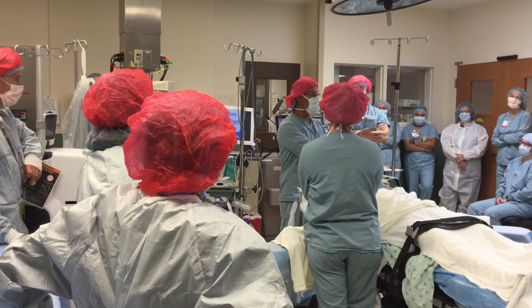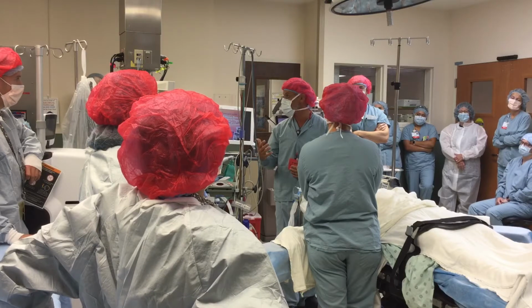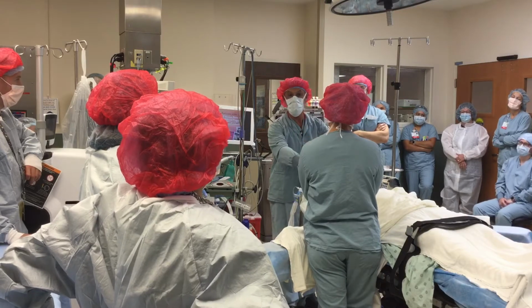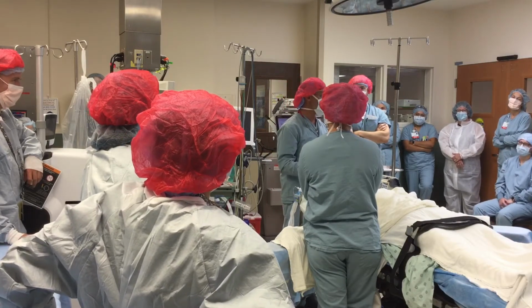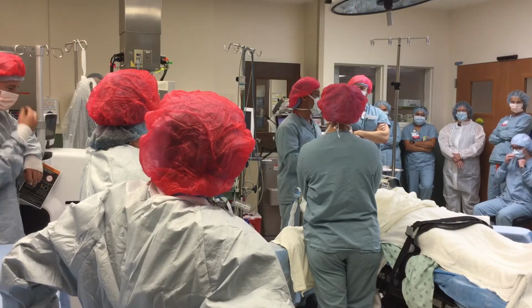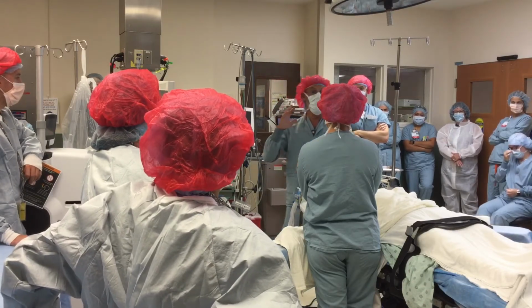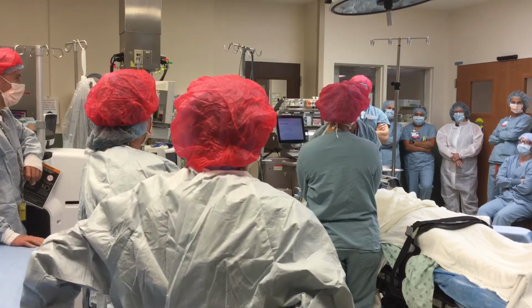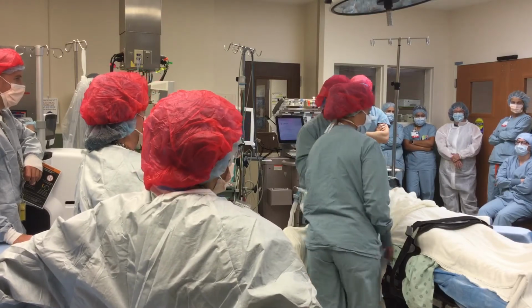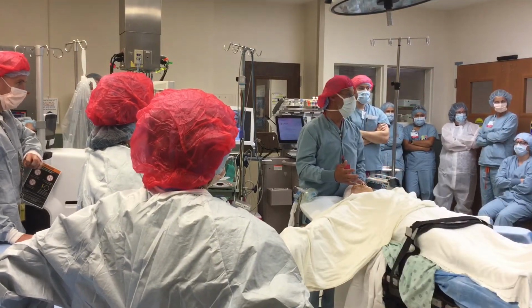In any code, take your own heart rate first, relax, and focus on the task that you've been designated. So in the room, everybody has the scenario in front of them. This person came in, we're putting monitors on, and all of a sudden we have a sudden change. It doesn't mean that everybody needs to start flopping around and screaming. Somebody calls for help, everybody goes. As a team of anesthesia providers, we're going to designate. Bailey, start applying pads, please, because we know that something is drastically changing, and we see the heart rate, the blood pressure is dropping precipitously.